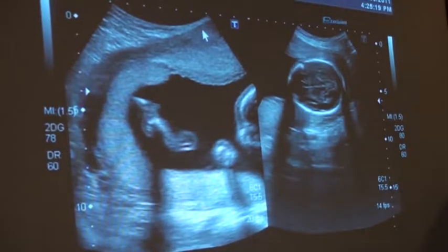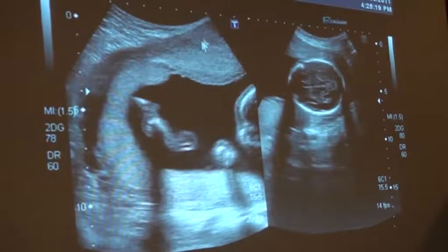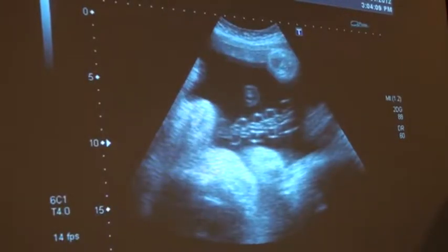Never mistake the segmental contraction for placenta. This is not placenta. This is the placenta. This is the uterine wall. And look at the uterine wall. It merges. You don't see that hypoechoic area at the back because this is a segmental contraction which should not be mistaken for placenta. Cord, you can have excessive cord twisting, which is something which needs to be followed up.